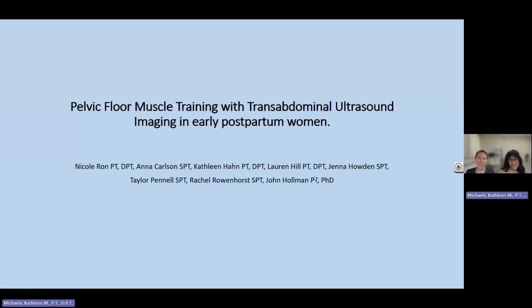We're pelvic health physical therapists at Mayo Clinic, Rochester, Minnesota, and two of the authors on this paper. This study included 75 volunteers who were in the acute setting, each 0 to 5 days post-vaginal delivery. Each participant completed a single session, including bedside transabdominal ultrasound imaging during pelvic floor muscle contraction.